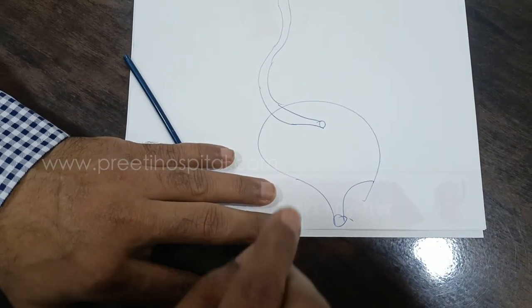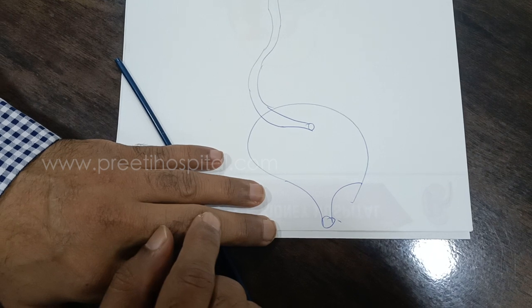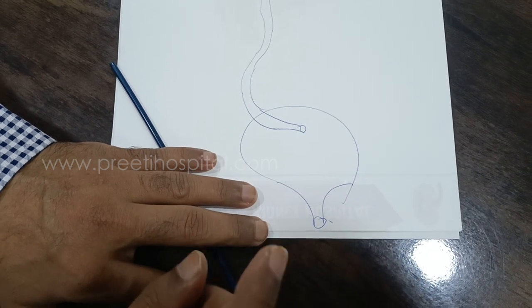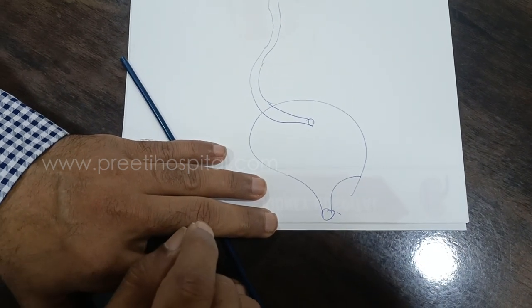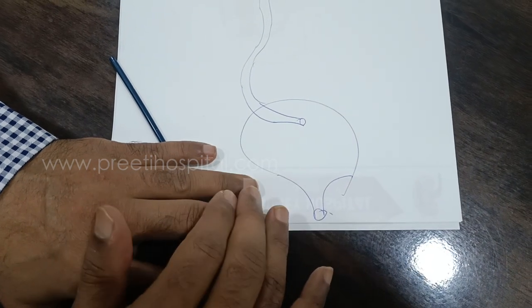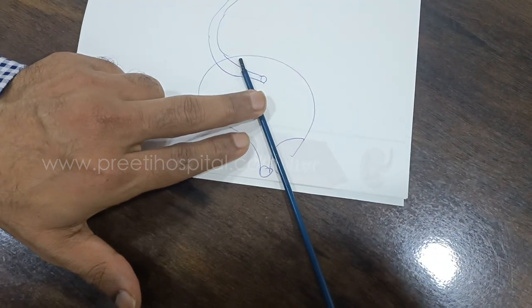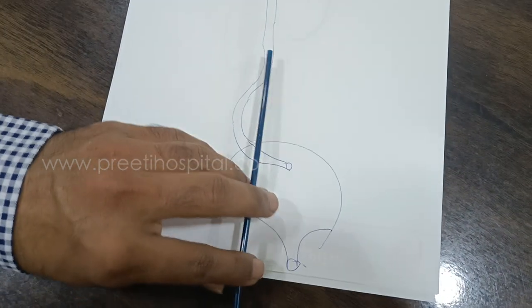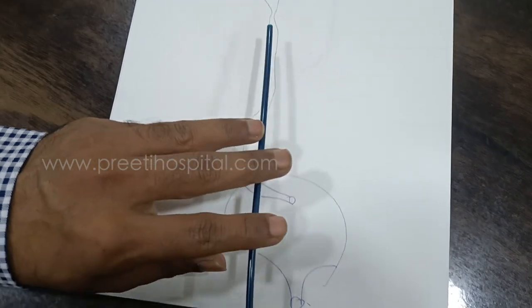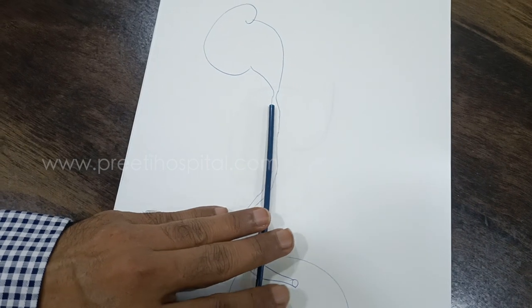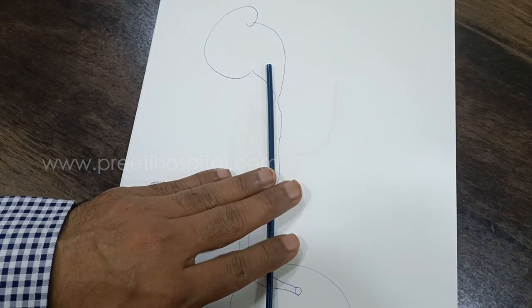Dear urologists, I am sharing a short video which is very important for the juniors. Generally, a lot of people ask me where to keep the access sheet - whether to keep at the lower end, at the middle, at the upper end, or at the pelvis.